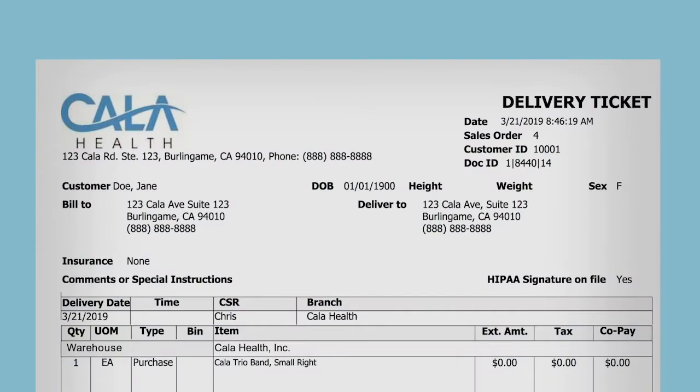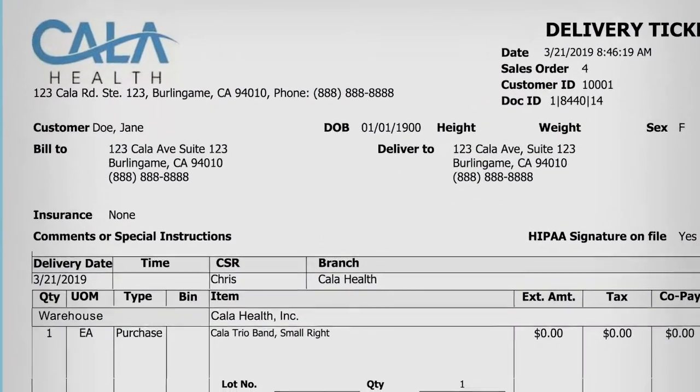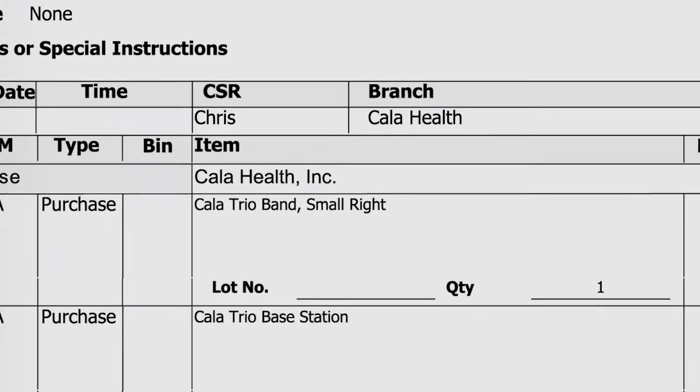First, look on your delivery ticket to locate which wrist Calatrio must be worn on. You can locate that information here.